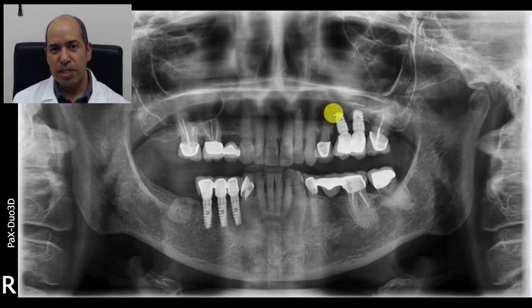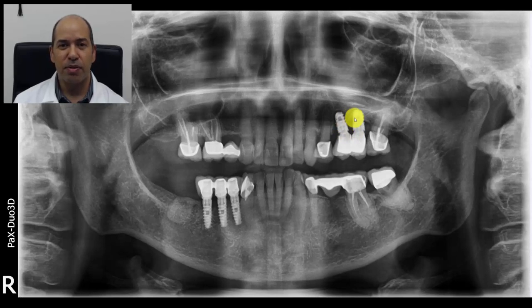Take a look at this patient I treated — this is another redo case. This patient had implants by another dentist, actually only about three years ago, upper right implants in this area. They were trying to avoid doing a sinus lift, so they put in these little small implants and connected them, which is better than leaving them disconnected because it's an area of high force in soft bone. It was like building a house on sand. These should have been longer. The diameter looks good on these lower implants — I did not do them — but these would be considered like normal size implants.